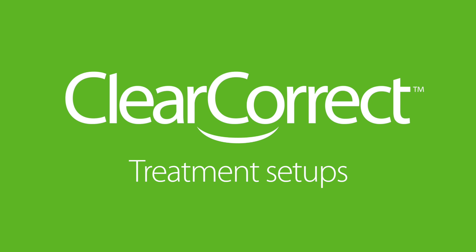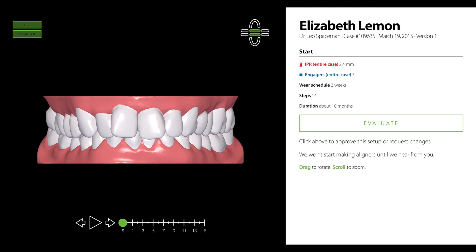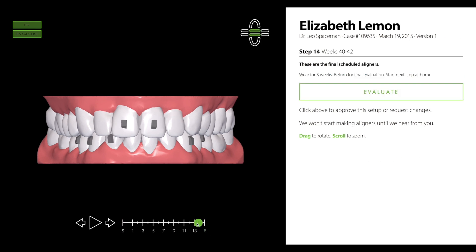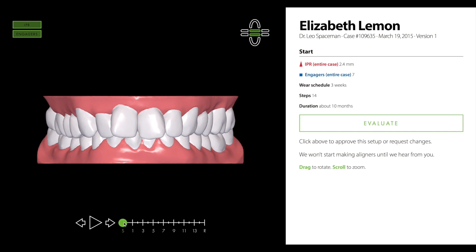Here's how to view and approve a treatment setup. A treatment setup contains 3D models for each step of the treatment, representing the tooth movements that you prescribe. If you approve the setup, these models will be printed and used to manufacture aligners.